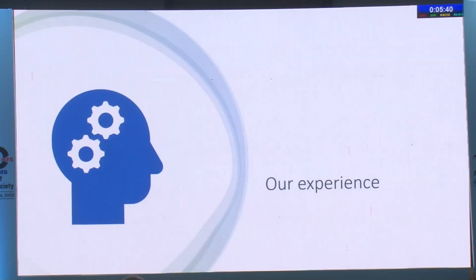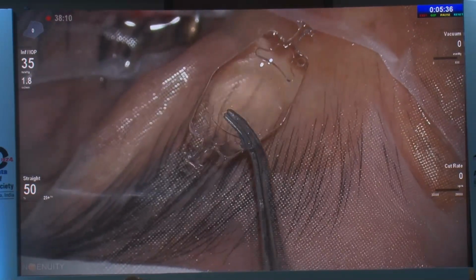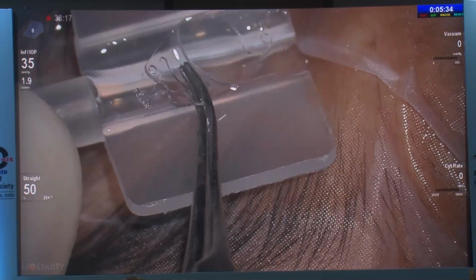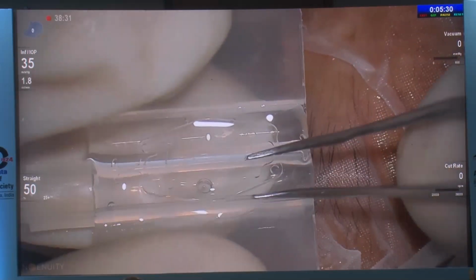So let's go with our experience. You can see this is the CMT flex lens. It has the angulation which is facing upwards towards you. You load it inside the cartridge.